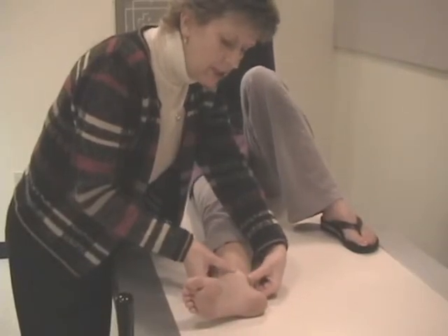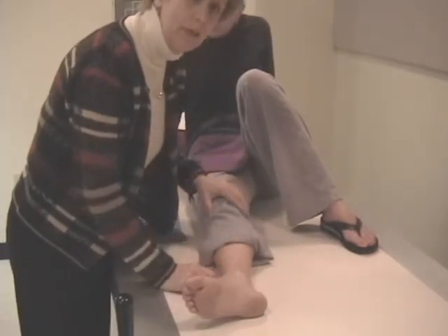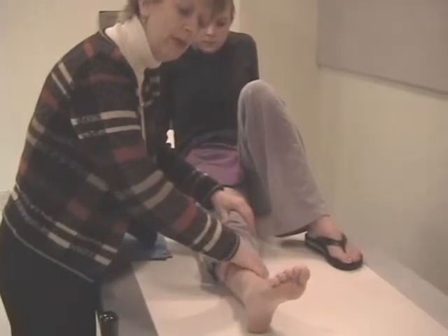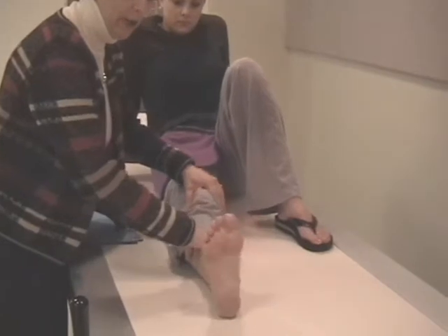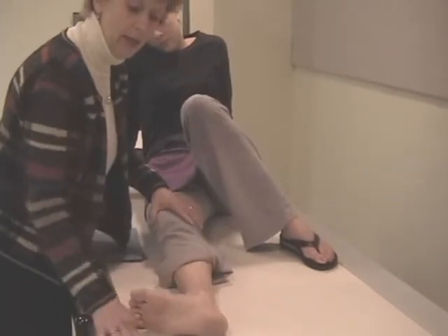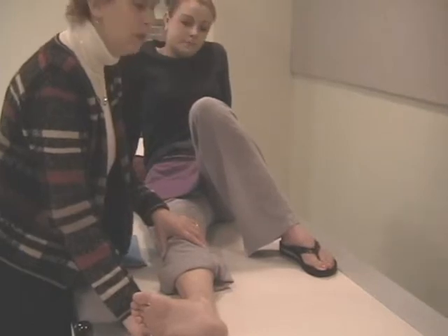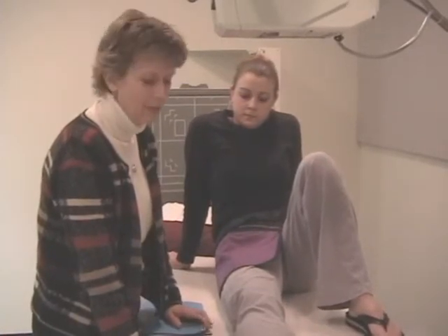You know, to feel the edges and to balance the fibula and tibia, one right on top of the other, can be very, very difficult. But if you remember what your degree of obliquity was with the AP mortis, if it's 15 degrees, all you have to do on your lateral, if your criteria is to have the intermalleolar line perpendicular, is to make the foot 15 degrees off the plane of the film. Was that explanation clear to you, Jacqueline? Yeah. Okay. We may have to discuss this more at a different lesson.